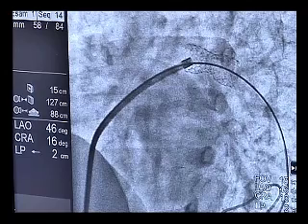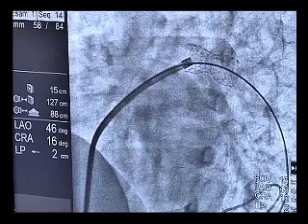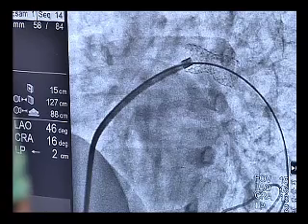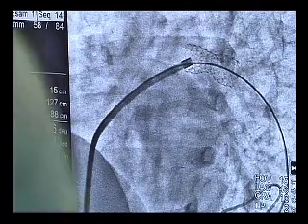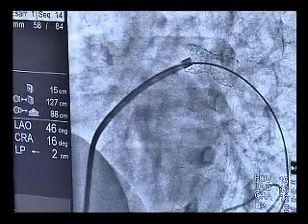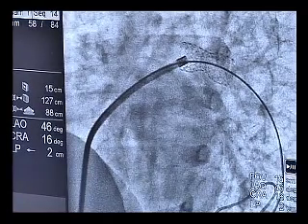We have to leave you in about 2 minutes to go to Belgium, but I think this is a very good result. I'm encouraged to hear there are pre-mounted stents that can be doubled in size. I've not seen that before. Yeah, we can try to redilate using a 10 millimeter high pressure balloon, and if it's too late for the broadcasting, we will show you in the afternoon before the next case. All right, that sounds great. Congratulations on an excellent result. If you can wait a few minutes, we are almost ready to perform.